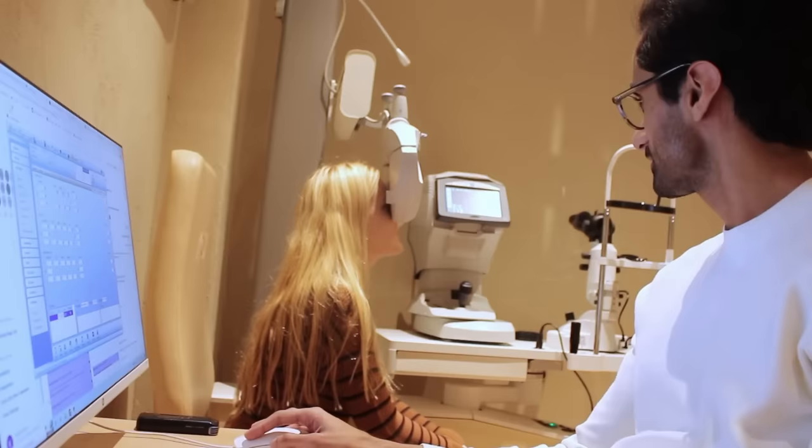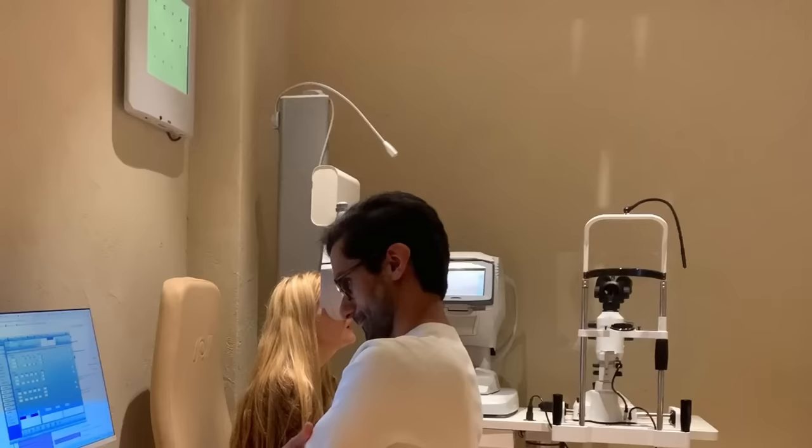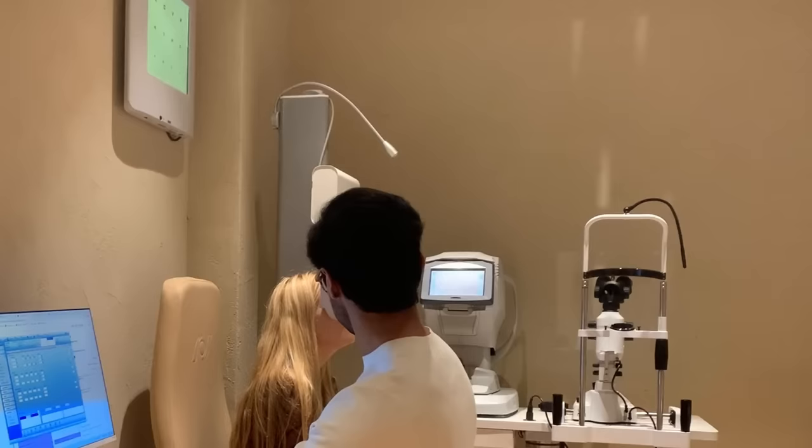Yeah. Cool. I'm going to go to your left eye. So again, this is no prescription. Can you go for the middle line? O-N-F-F. Okay. Better? Much better, yeah. Okay. Try the last line. L-C-N-K. Okay. Now one. And two. That's one. And that's two. I think one is better.